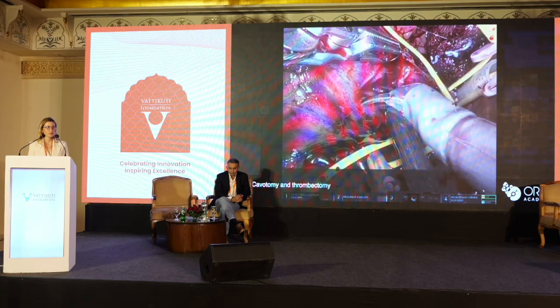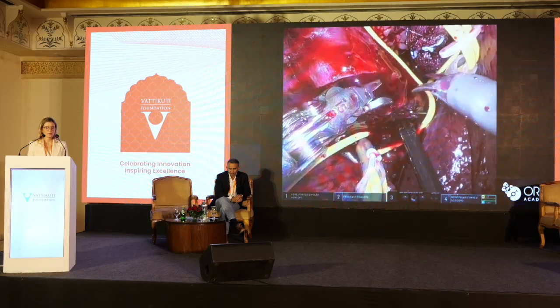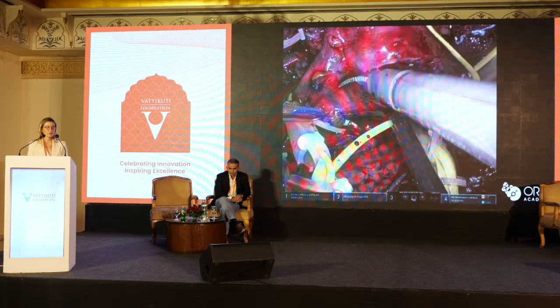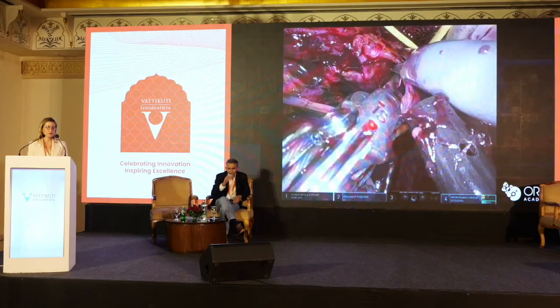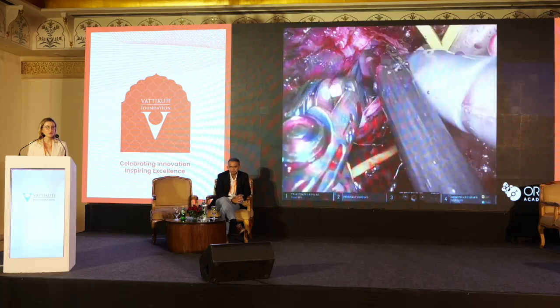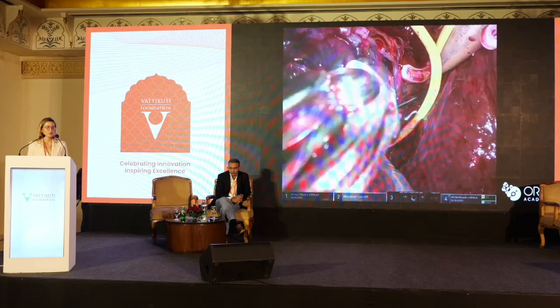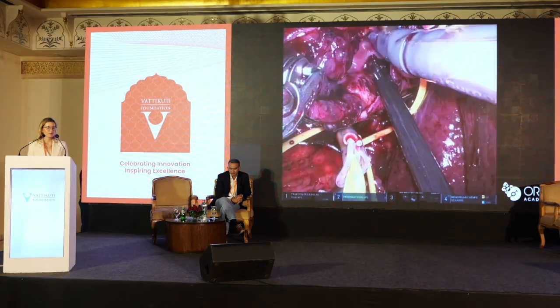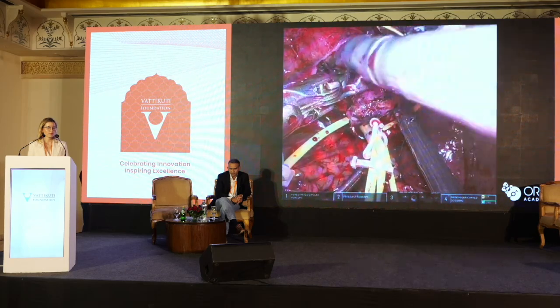We start the cavotomy in the anterior surface of the cava. We remove the tumor thrombus with en bloc extraction, and after this step we cut the posterior face of the renal vein and also the distal end of the thrombus.